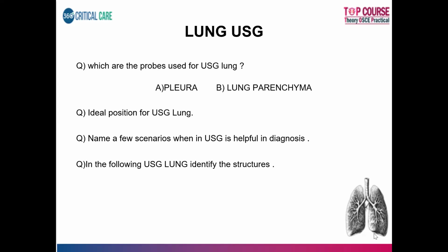You can go on telling a lot of differentials. You can diagnose what all problems with lung ultrasound. Can you diagnose pneumothorax? Yes. Can you diagnose consolidation? Can you find out atelectasis? So all of this is possible, right? So you have to remember a few scenarios.